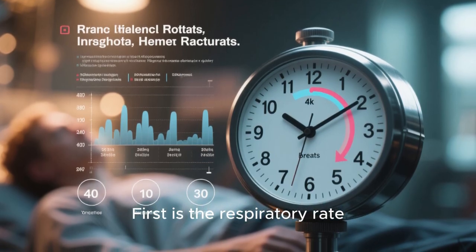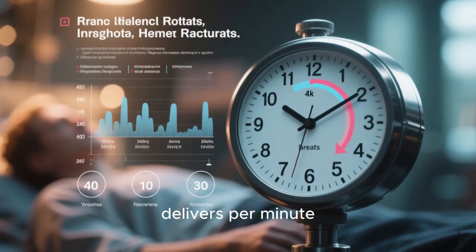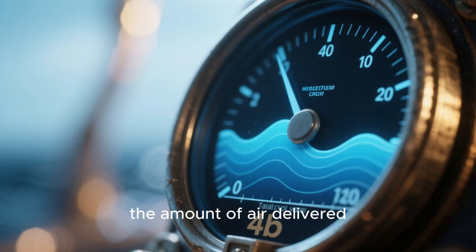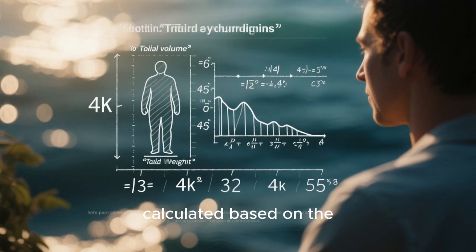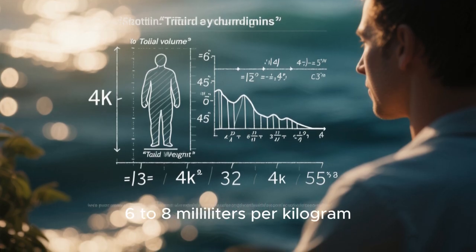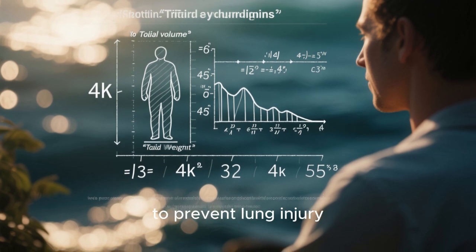First is the respiratory rate, which is the number of breaths the machine delivers per minute. Next is the tidal volume, the amount of air delivered with each breath. This is usually calculated based on the patient's ideal body weight, typically around 6 to 8 milliliters per kilogram, to prevent lung injury.